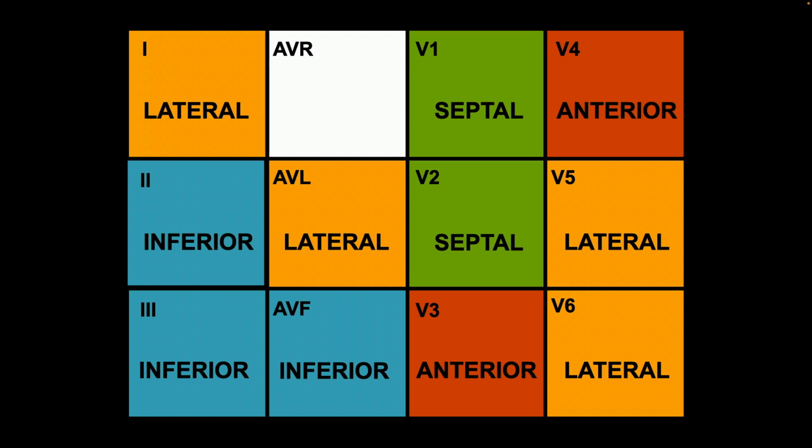And what that means is that at this point everybody thinks, oh, I've got it, 2 or more leads of ST elevation and we've got a STEMI. For a lot of the ones that we looked at, I cherry picked them of course because we're just starting off, the ones that really jump out of the page at you.